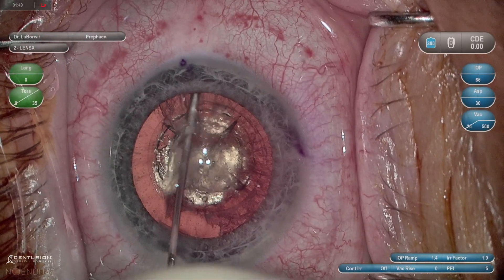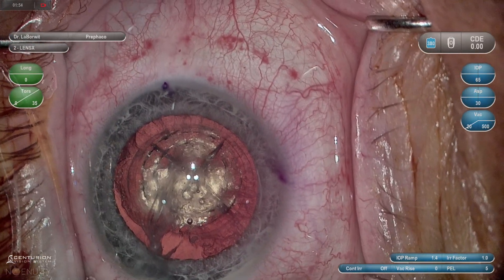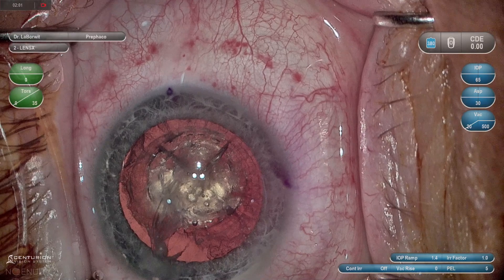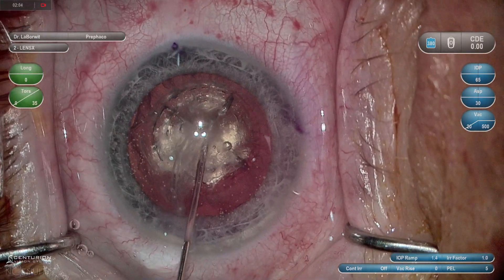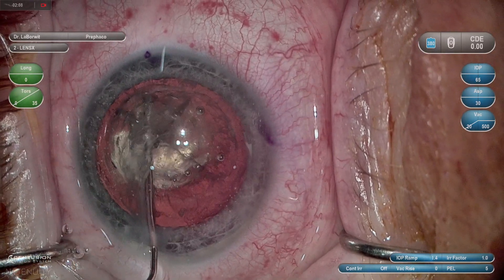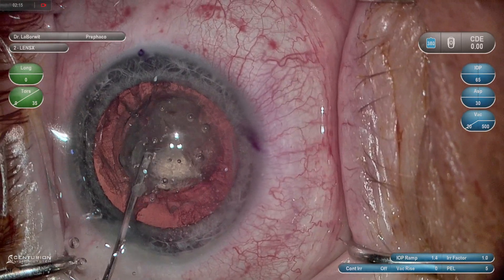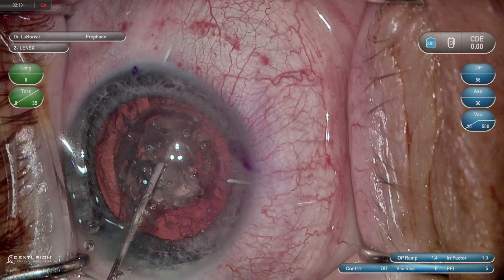Next I want to share how I leverage this technology in the operating room. I routinely visco-dissect to the equator, knowing there are air bubbles pneumo-dissecting the posterior aspect of the cataract off the capsular bag. Next I'm going in with a hydrodissection cannula to the horizontal cut and you can see how I'm able to hydrodelineate, and the top 50 percent of the cylinders easily lift off because of that horizontal cut.